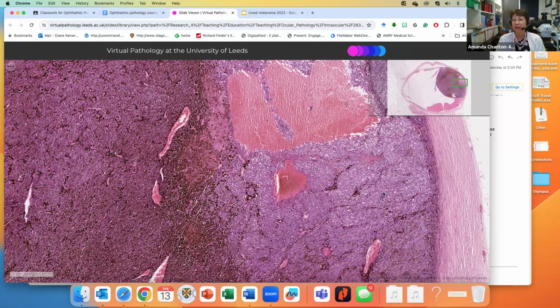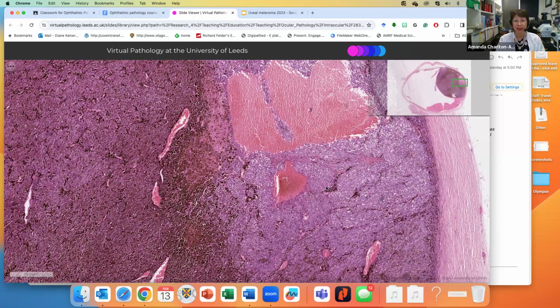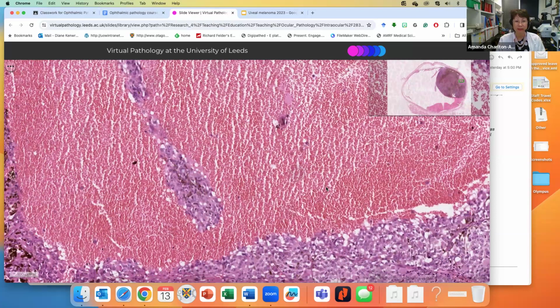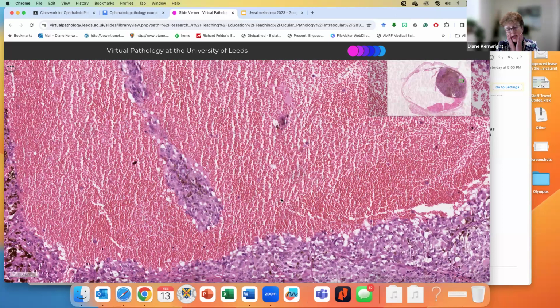How do we determine if it's just hemorrhage or hemorrhagic necrosis? Let's have a look at some hemorrhagic areas. There's a big lake of red stuff up there. I can see several of those. What could that be? Looks like a sea of red with not much in it, so it looks pretty fresh to me. I think this is just hemorrhage, because if it was dead tumor, I'd expect to see pink with purple necrotic bits in, and maybe the ghosts of some structure. If it's hemorrhage, it's just a sea of red.